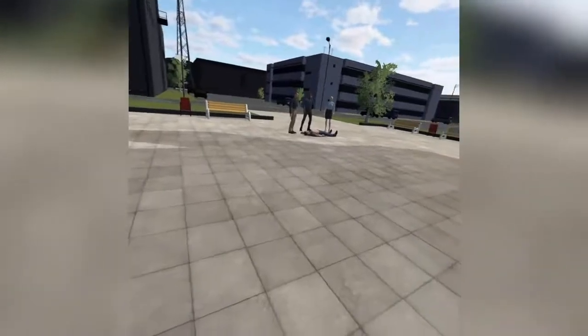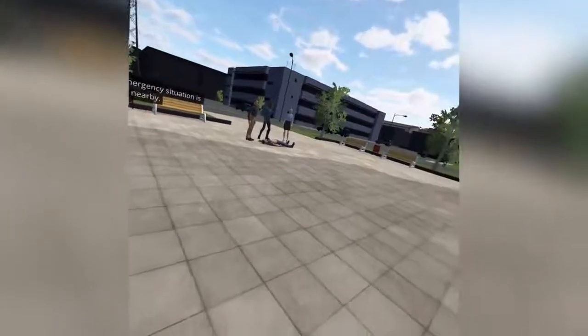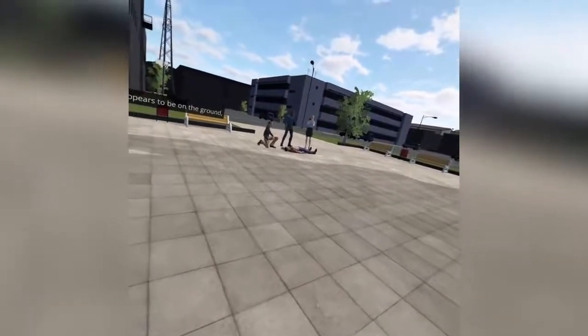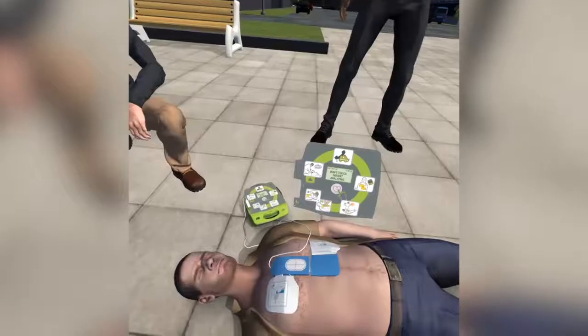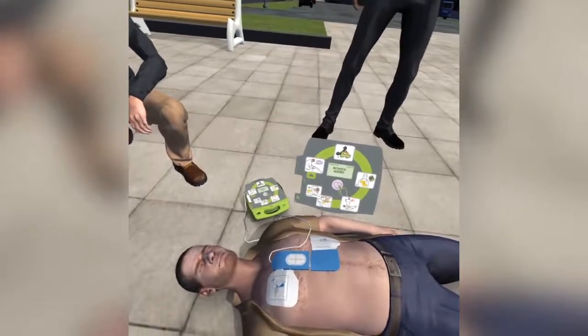The VR app will run through a short scenario, then change perspective to you being over the top of the victim in position to provide CPR compressions. When you realize an emergency situation is happening nearby, someone appears to be on the ground, unresponsive and not breathing.